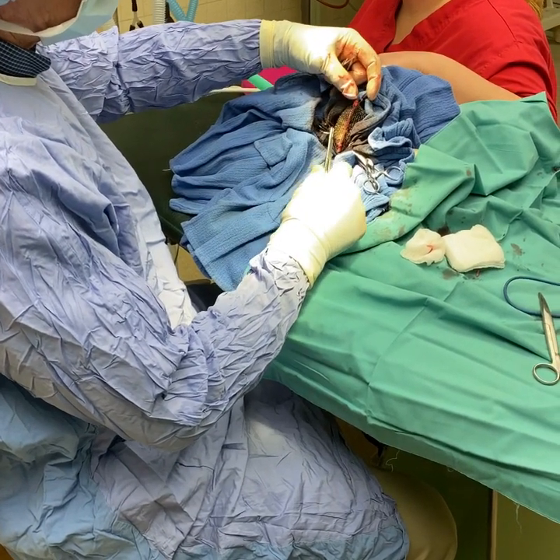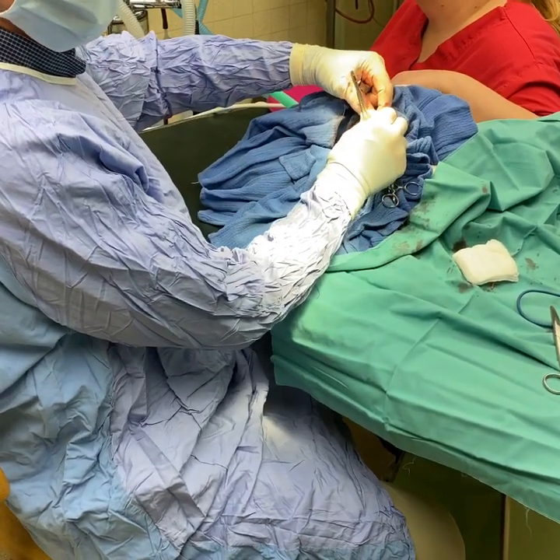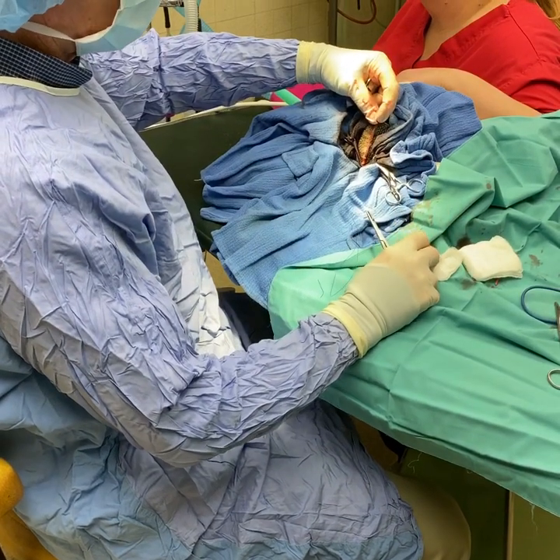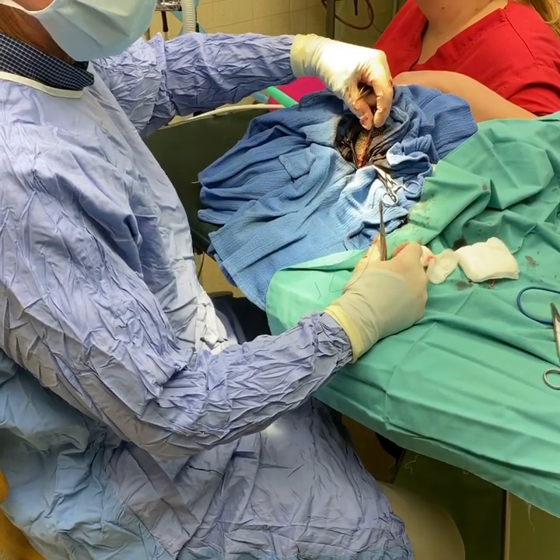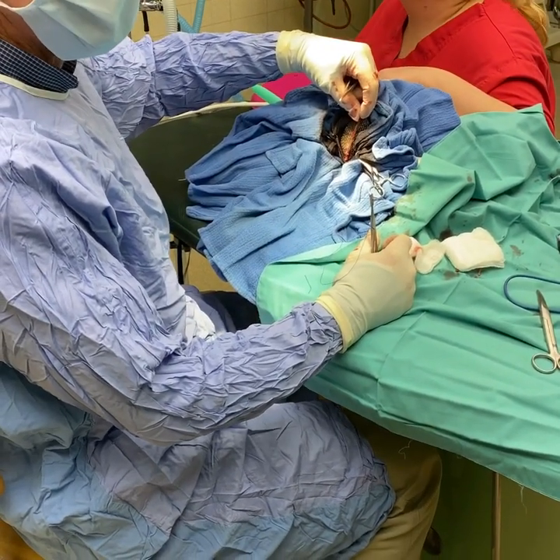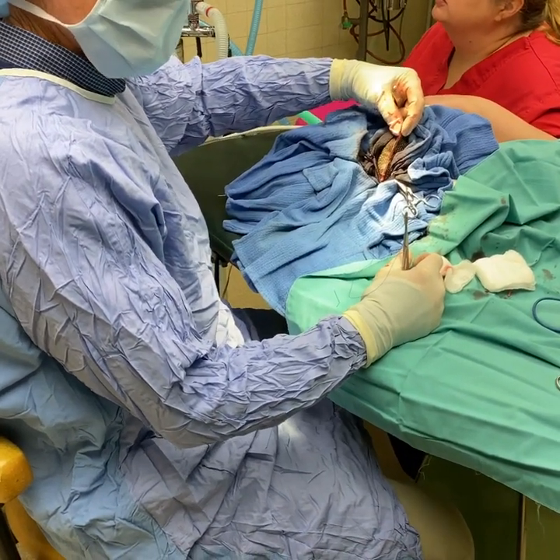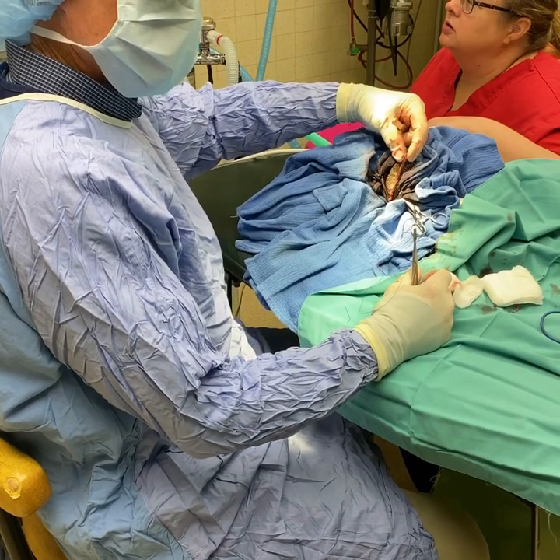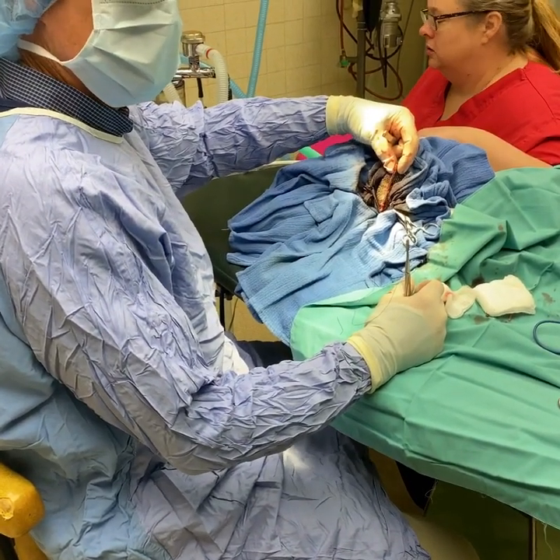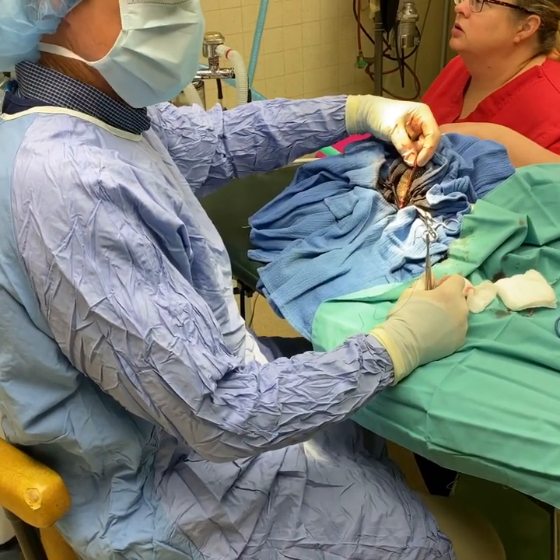Technician Jennifer, turn off the anesthetic now. Reptiles don't wake up super fast, so we want to give them every chance to wake up smoothly. We're turning off the anesthetic early and allowing some oxygen for a little while, then quickly going to room air, because their impetus to breathe is not CO2 as it is in mammals — it is oxygen-driven. As long as we're giving the animal oxygen it won't wake up, so it's best to give them room air as soon as possible.